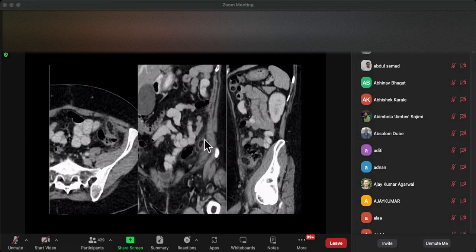We've got it here, and we've got it here. And the importance in making the diagnosis is to establish the diagnosis, make sure there is no other surgical cause for the patient's abdominal pain, and then tell the surgeons, look, this is a self-limiting condition, epiploic appendagitis. You don't need to do anything dramatic with this patient.